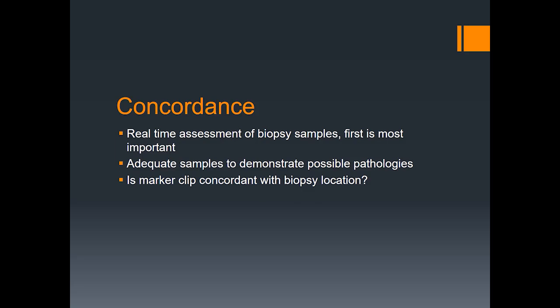There are certain reasons, either a very young patient or the marker clip would be out of the field of view of a mammogram, or bleeding was significant and could be restarted with a mammogram, where we might want to delay it. But we want to get it as much as we possibly can. Do the pathology findings fit the clinical and imaging scenario? And again, thinking about our patient from start to finish longitudinally.